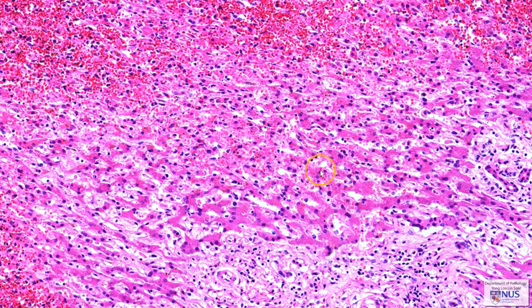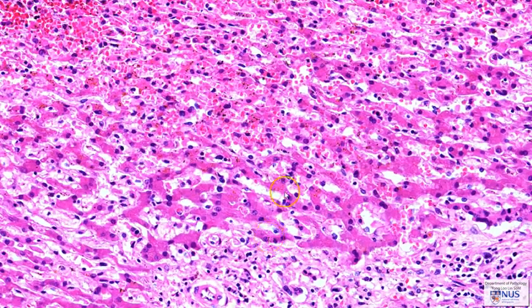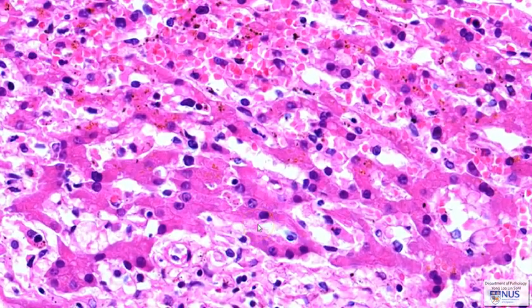Let's have a quick look at the uninvolved liver parenchyma. We can see the hepatocytes that are arranged in cords, and the cords are quite widely spaced apart because of the presence of some edema and congestion. The hepatocytes themselves are polygonal cells with central rounded nuclei and quite abundant granular cytoplasm. So these are viable hepatocytes.